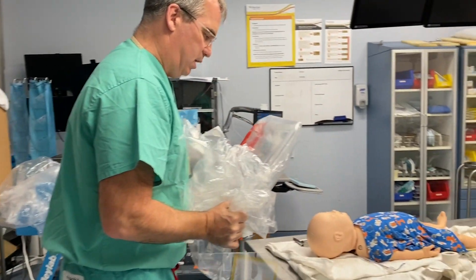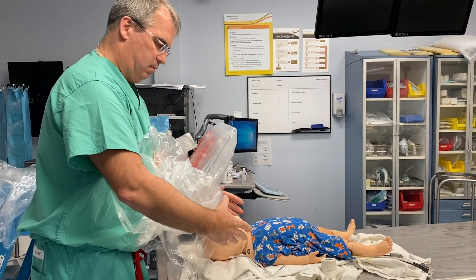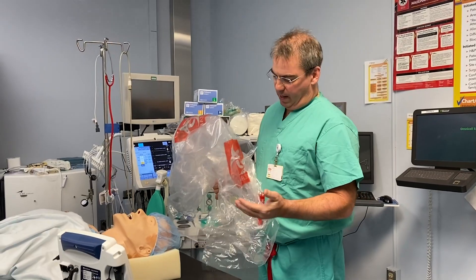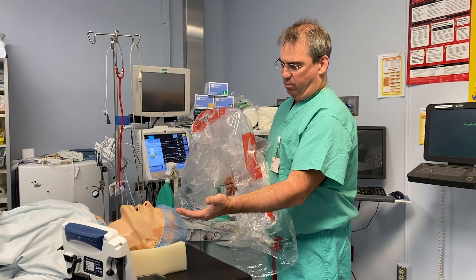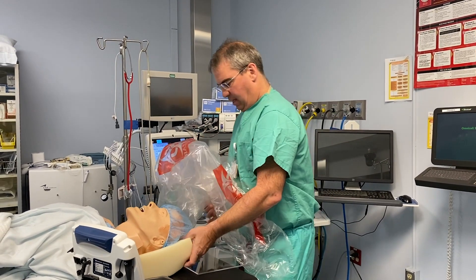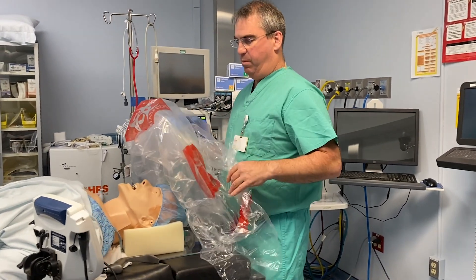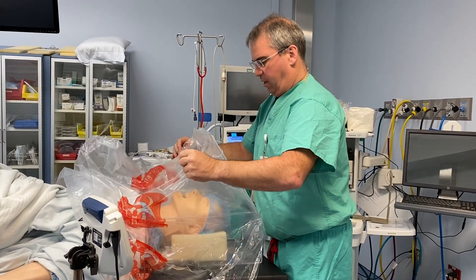Now we can place the screen for the baby — they would cover the baby. So I can either place the shield at the head of the bed as we move the patient over, or I can move the patient over with a mask on and then place the shield under the head of the bed. I would then inform the patient I'm going to cover them up, and I cover them up and make a nice little tent around their airway.